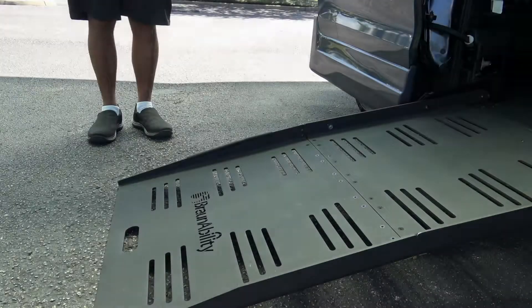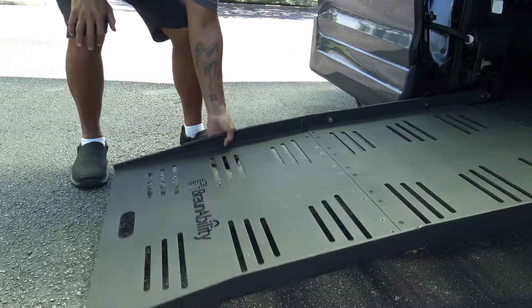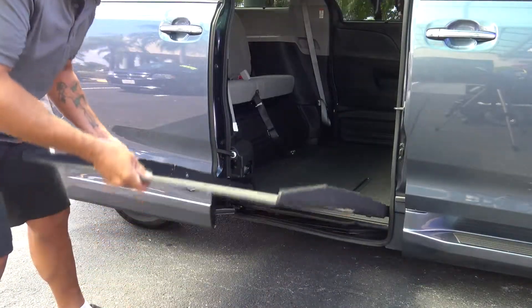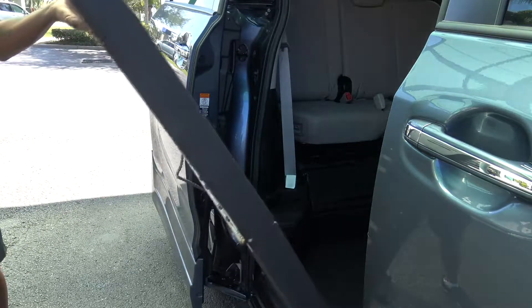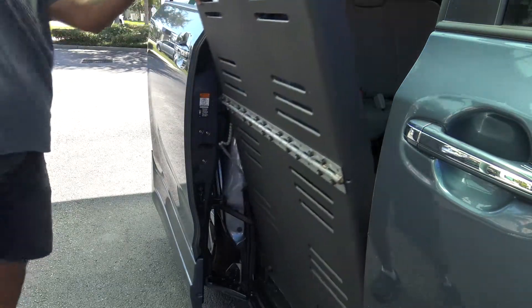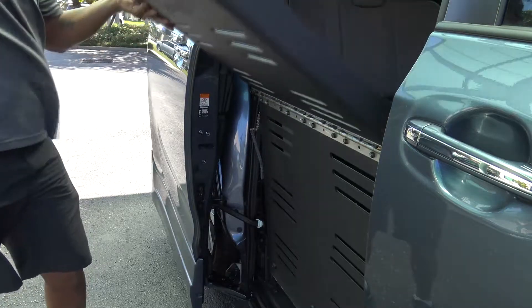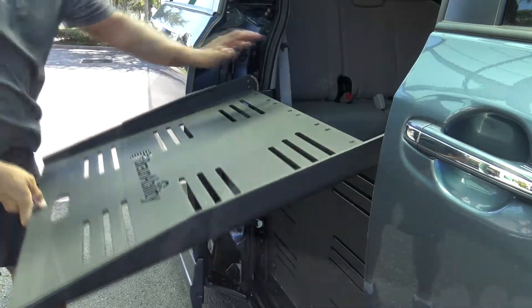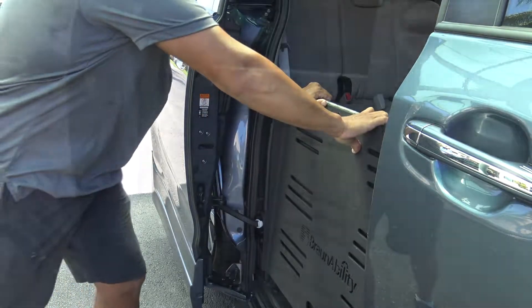To manually stow the ramp back into the vehicle, grab the side of the ramp first and begin to lift. When the ramp has sufficiently cleared the ground, grab the handle with your other hand and continue lifting using slow, steady pressure. When the ramp is just about vertical, begin to slowly fold it and continue applying pressure, paying attention to the chain, and pushing inward until it is back into its proper resting position.